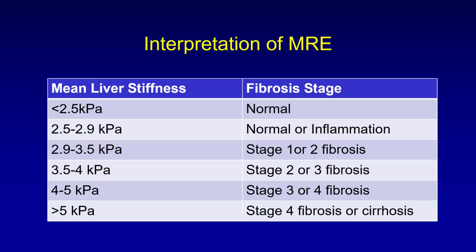These values are given for all the vendors, because at present most of these vendors are using the Resoundant active driver and the same passive driver. So you can use these across all vendors, unlike the ultrasound values, where machine to machine you may have different interpretation values.